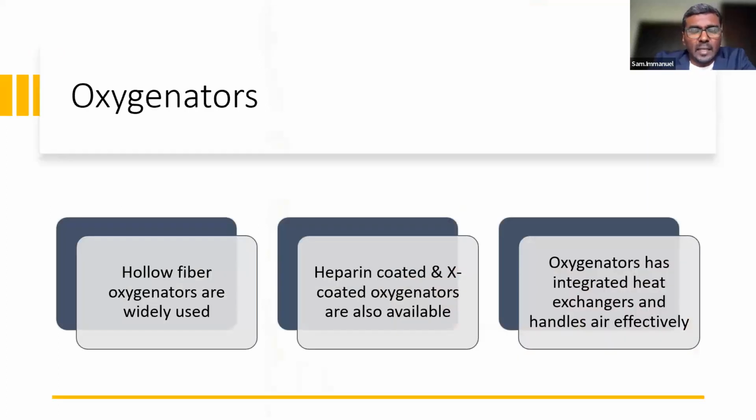Coming to an oxygenator, as we all know, the oxygenator plays a vital role in pediatric or any type of CPB. Oxygenator selection lies with the perfusionist. If I ask you which oxygenator is best, all of us have our own preference, but I would like to emphasize that choosing an oxygenator wisely for the case you are going to do is the technological update, and that is the most important thing required.